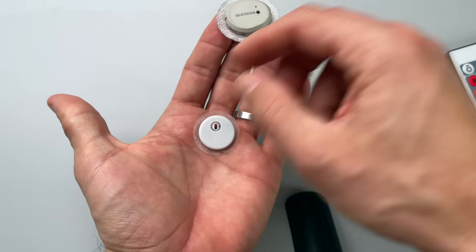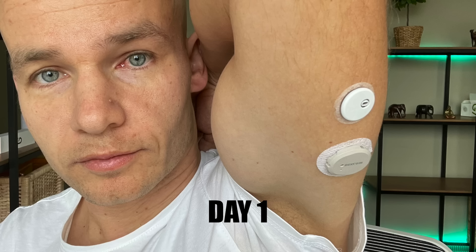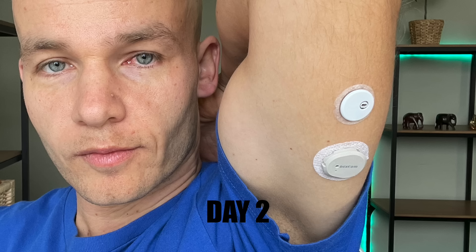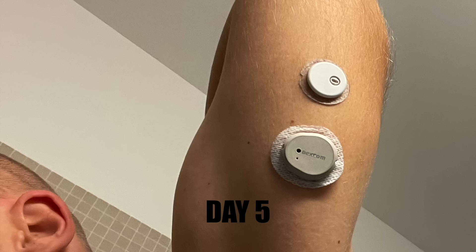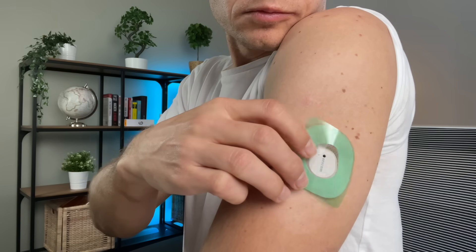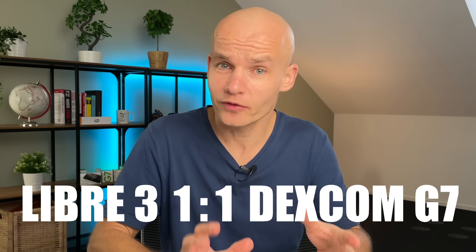Difference number three: sensor adhesive. It's a super important topic because it doesn't matter how long the lifetime is if your sensor peels off during your first shower. I've always liked the Freestyle Libre adhesive — it works really well with my skin. Although the Libre 3 adhesive is a lot smaller than the previous Libre sensor, it still holds really well even in extreme conditions. Dexcom's adhesive is simply not as strong as Libre's and always starts peeling off after a few days of wear, which is why it's helpful that Dexcom includes the overlay. Overall, Freestyle Libre's adhesive is simply better.